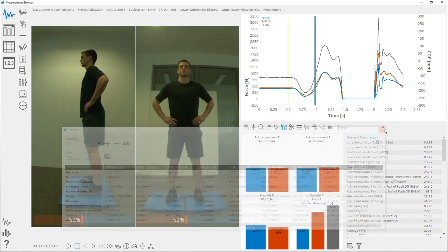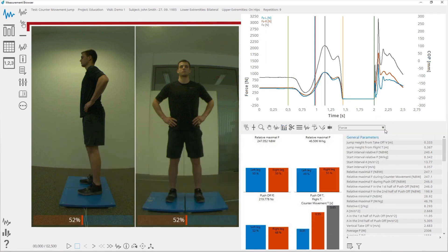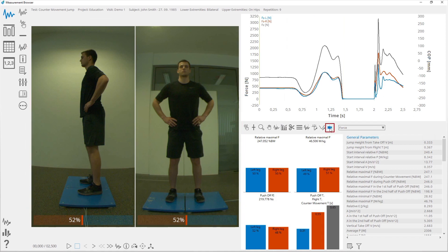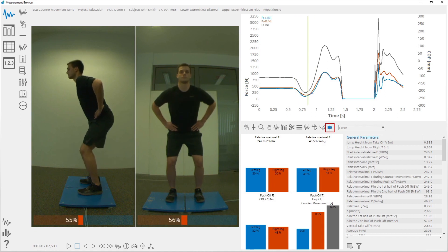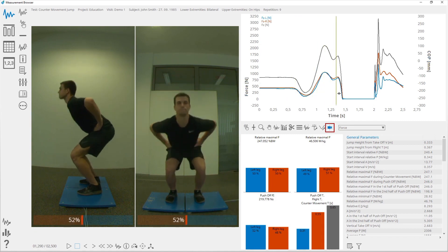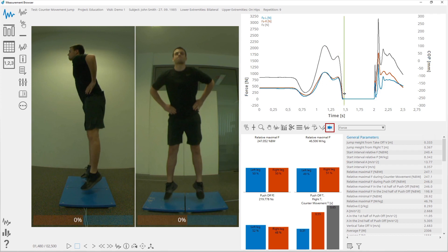In case a measurement contains a video, there is an option to show the video cursor. When moving the video cursor on the graph, the corresponding video frame will be shown, and vice versa — clicking on the graph shows the corresponding video frame.